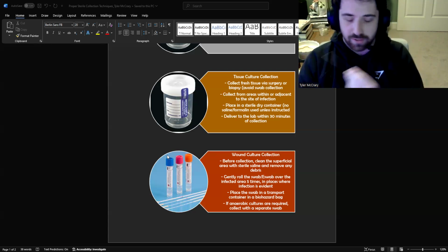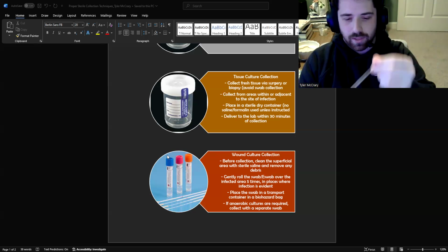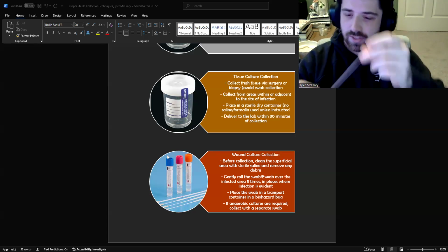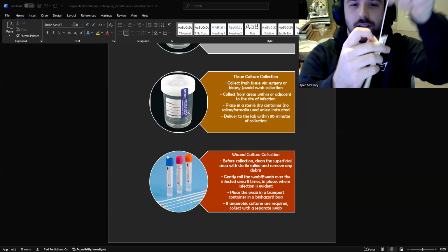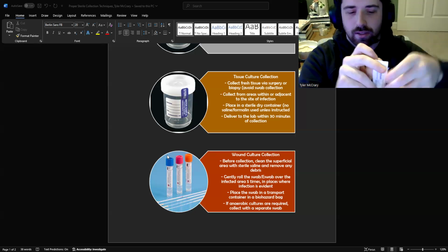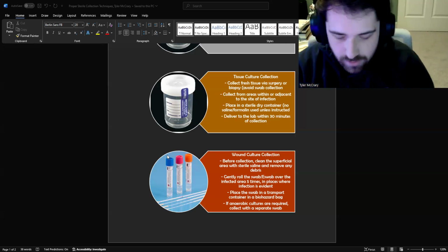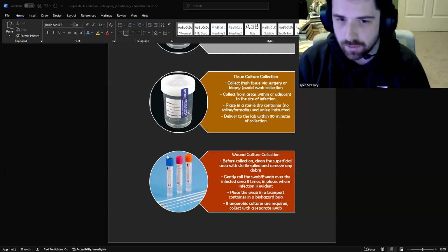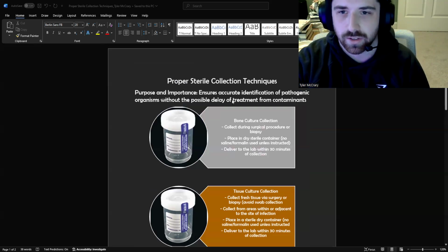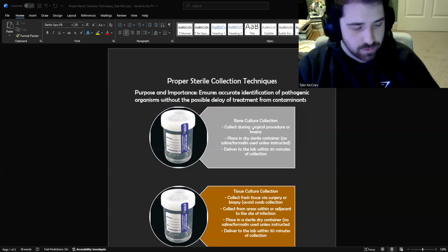So we have received these before in the lab where the nurse may just go and rub this on the infection site, stick it in an existing swab packet and send that to the lab. But we have to reject that because it's not sterile. There's probably contamination all over it, and it would invalidate the results. And the overall purpose of sterile collection is to ensure accurate identification of pathogens and to avoid any possible delay in treatment.